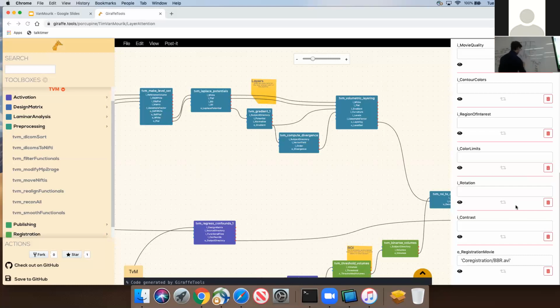So in this case, this voxel has 0 white matter in it, but 5% of layer 1, 40% of layer 2, 25% of layer 3, and 30% of CSF. And you can do that for every single voxel.